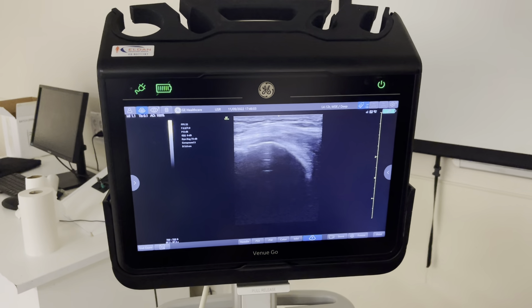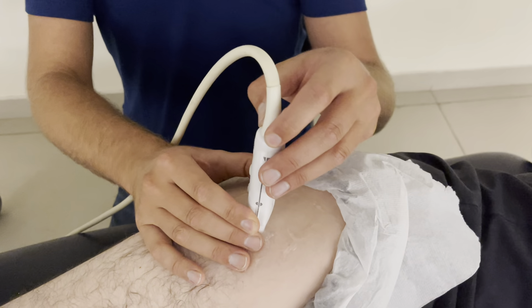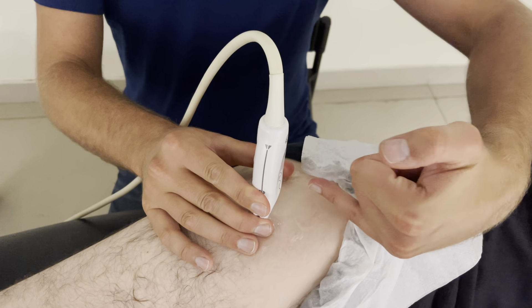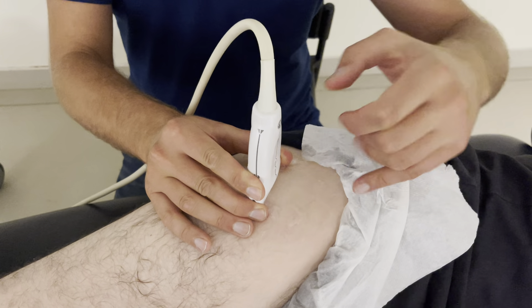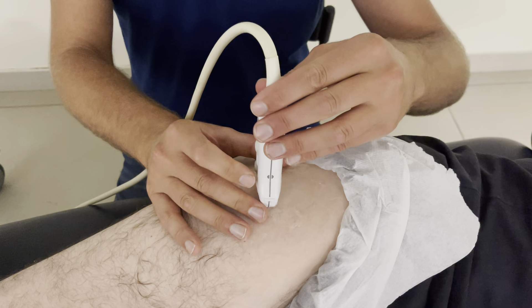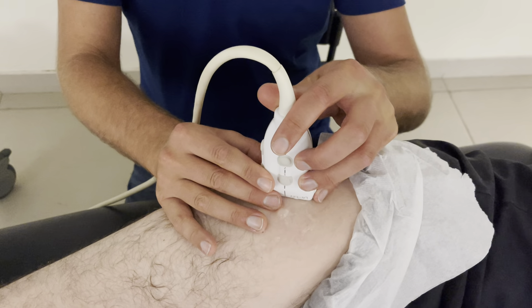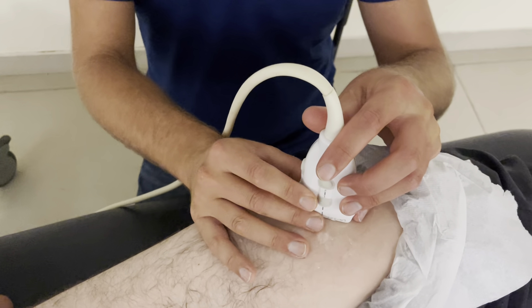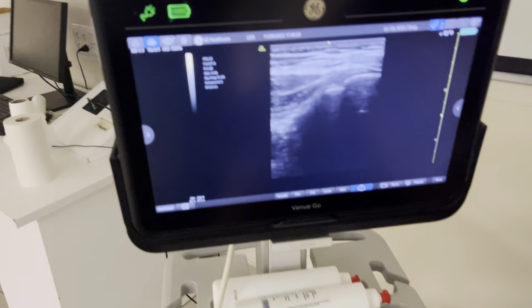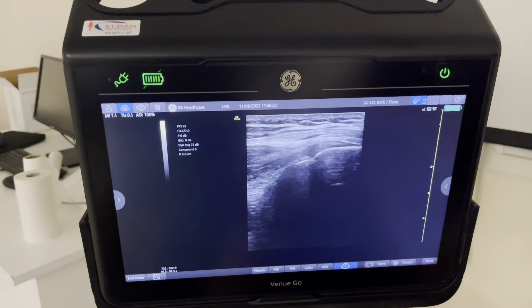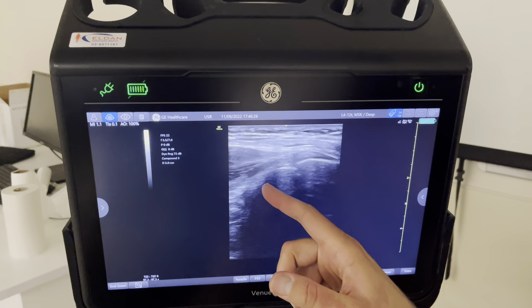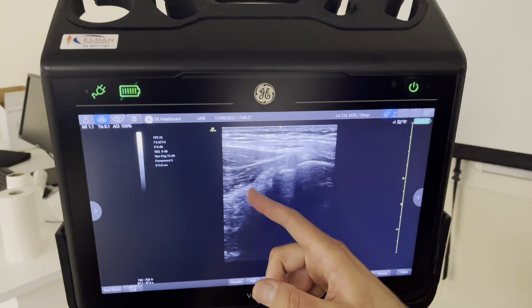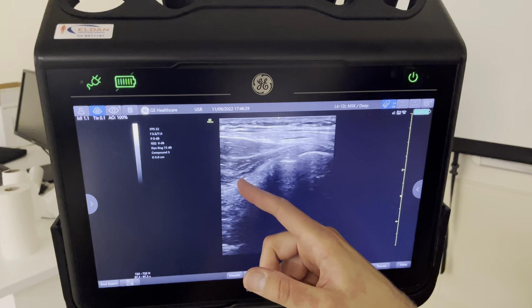So this would be the short axis view of the tendon. Now we want to go into a long axis view. It can be quite anterior, like this. In his case it's not so much anterior. Once I have the image as good as I can — like this — you see with him, this is the angle I'm scanning at, and you get a very nice view here of the tendon coming up.